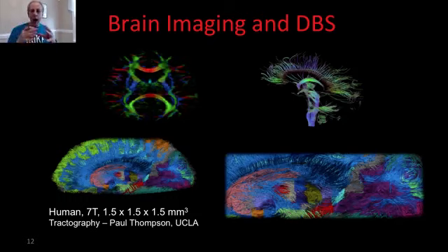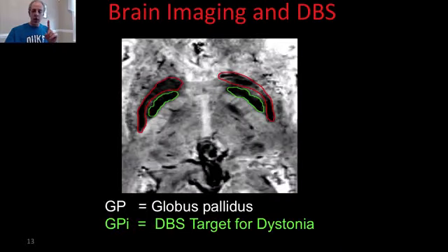And then when you have all that, which is already one of the image processing challenges, you start doing other image processing things, like, for example, image segmentation. You might be able to automatically or semi-automatically, for example using active contours, segment and mark the regions that the neurosurgeon knows are the target regions. So you develop active contours that are specialized to this type of challenge.